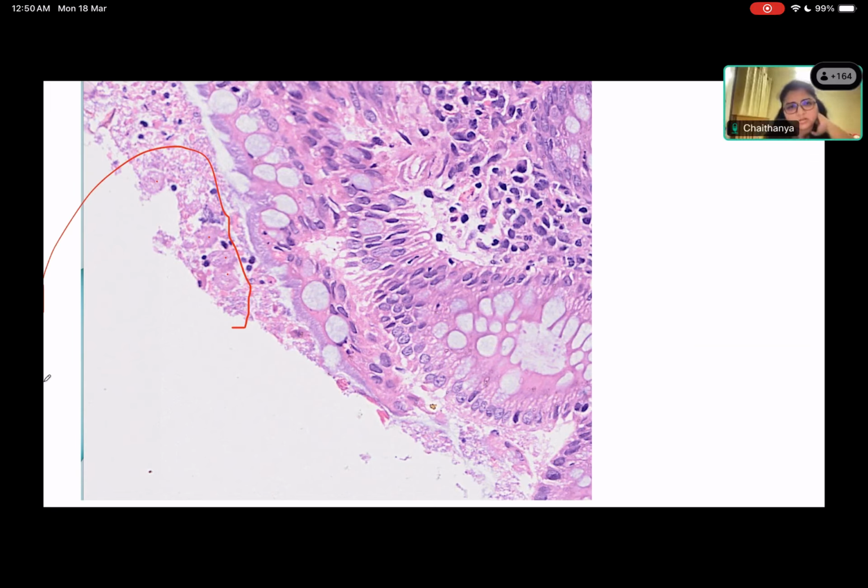Microvilli. Microabscess. What micro? Villi. Which ones? The brush border. What color should the brush border have? And will it appear so prominent? You're very right. This is the area of interest. So this is not brush border. The brush border is usually a little shorter than this. It's pink in color, not this bluish color. So brush border shorter, pink in color.